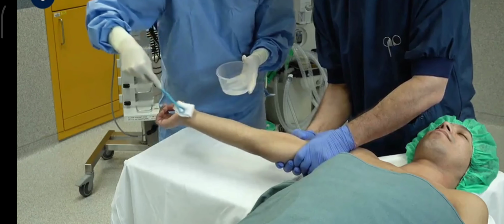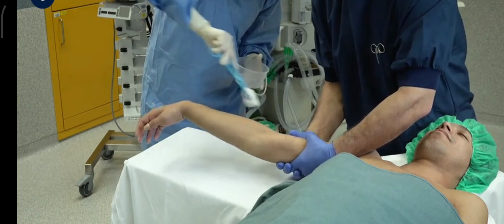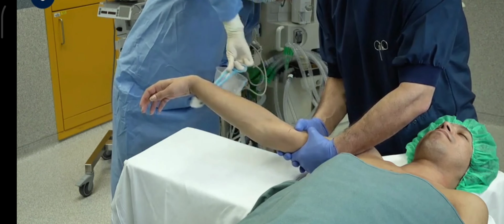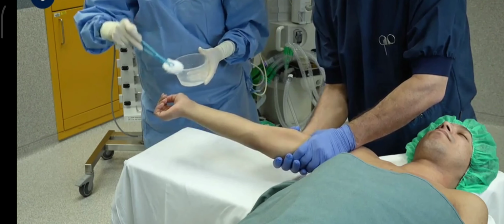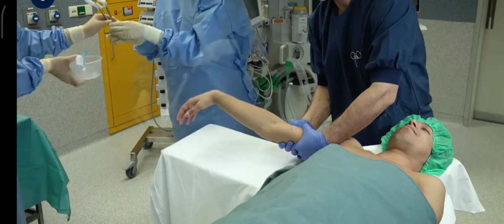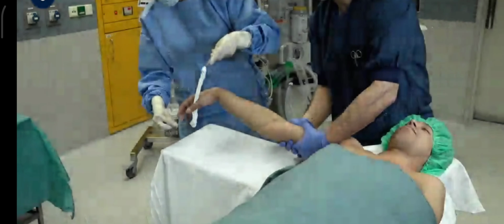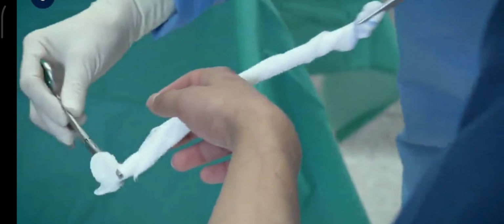In this instance, the entire extremity is considered to be clean, and the disinfection progresses in a proximal to distal direction, with the assistant rotating the arm to allow the entire circumference to be cleaned. The hand is cleaned as shown. To clean in between the fingers, a gauze wick held between 2 clamps can be used. The use of the gauze wick is now demonstrated in close-up view.